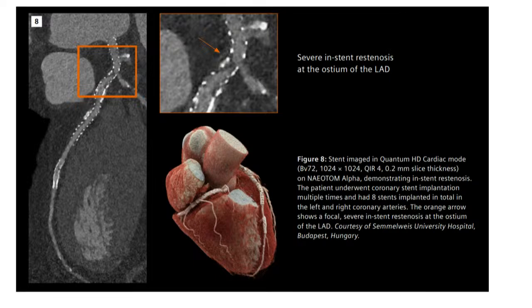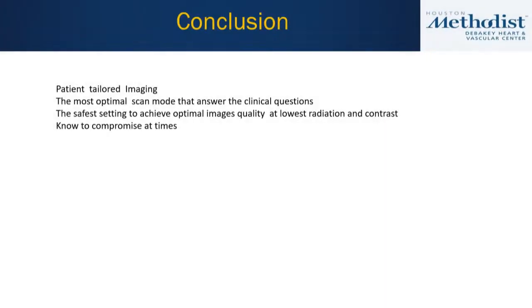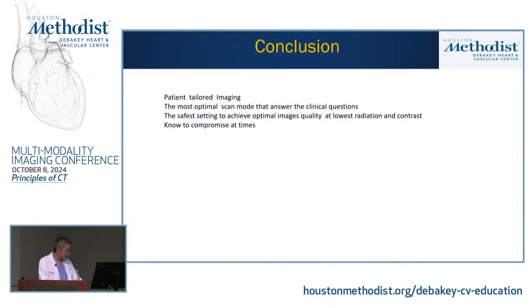So exciting development, and hopefully we will learn more. But in summary, I don't need to repeat everything I just said. I mean, the idea here is for you to understand how the CT scan works, how we get the images. And if you're interested, you have to go through each step, which allows you to do certain things to essentially answer your question.